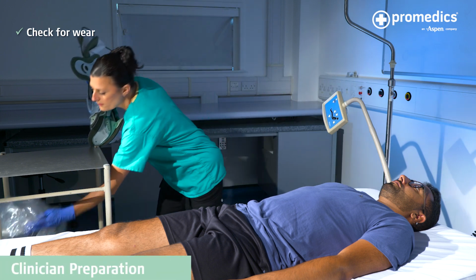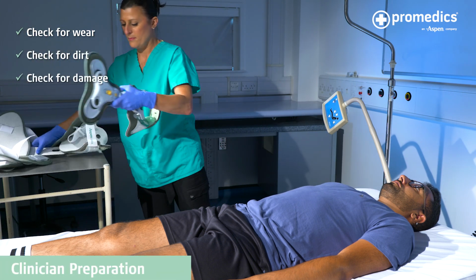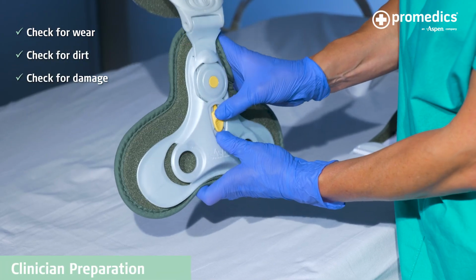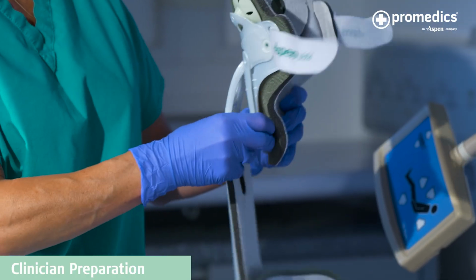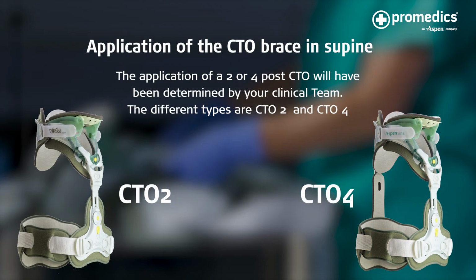Check the product is in full working order by testing all the adjustment points, as shown. The application of a 2-post or 4-post CTO will have been determined by your clinical team. The different types are CTO2 and CTO4.